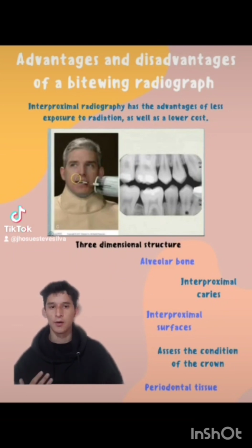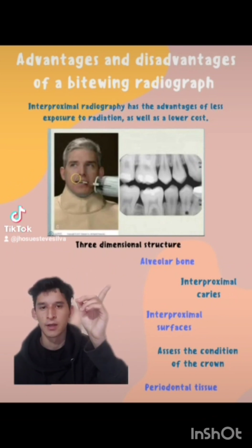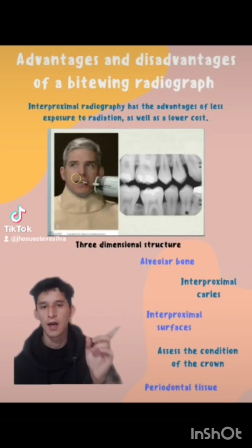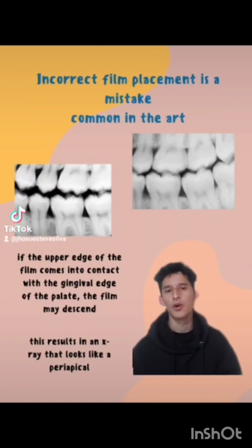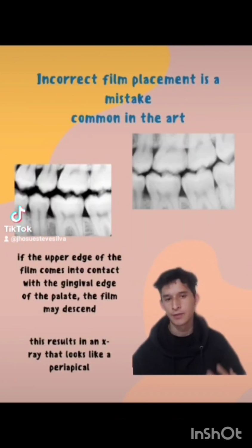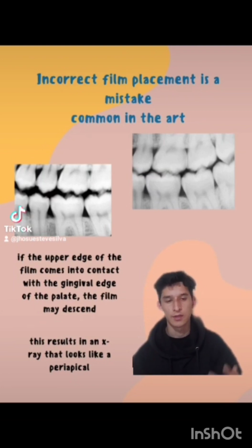The objective of this technique is to outline images of the crowns or cervical area of the maxillary and mandibular teeth. We can observe, for example, alveolar bone, interproximal caries, interproximal surfaces, and periodontal tissue. As this graphs a three-dimensional structure on a flat surface with only two planes of space, the pathological process is not always seen.